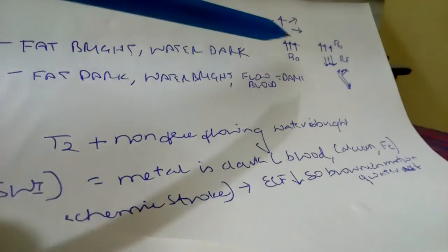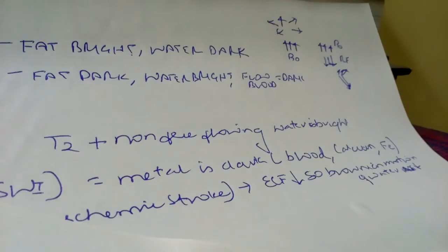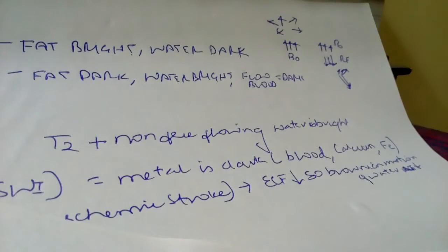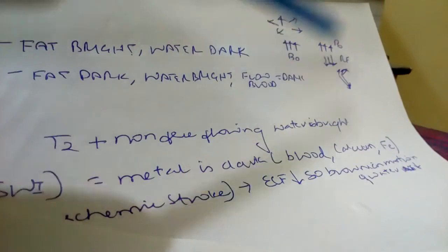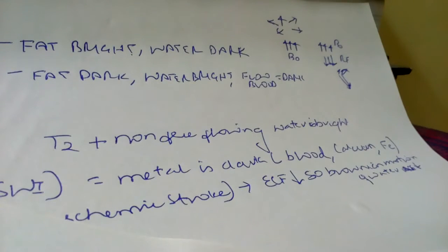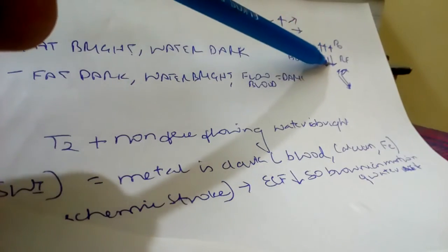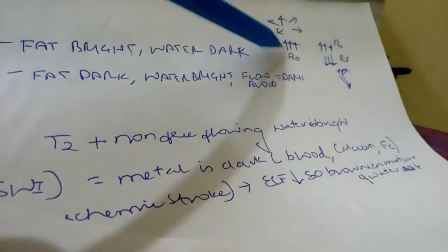Now, when all the protons are in one direction, nothing can be gained out of it, because there is no difference in the signals. While these protons are all in one direction, they spin like a top, and this spinning has a particular frequency, which is called the Larmor frequency. When we want to study something, we apply another frequency, called the radiofrequency pulse, which is generally in the opposite direction and will lead some of the protons to go into a higher energy state, opposite to that of the normal B0 magnetic field.